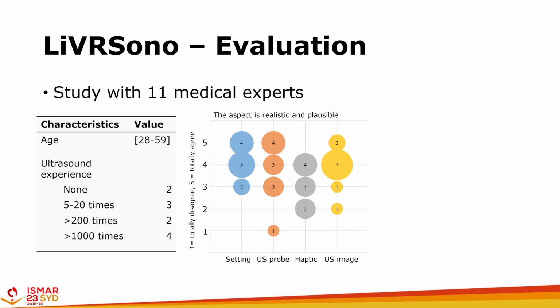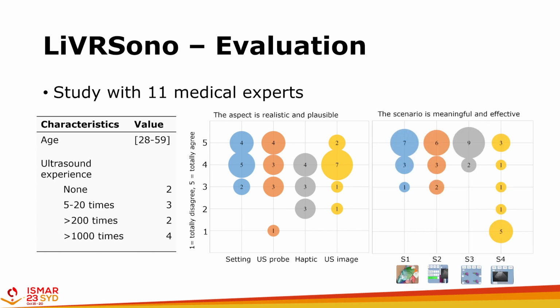The haptic was rated not that positive because of jittering and a limited range of movement of the device. In the second part, they had to assess the learning scenarios, so they were asked how meaningful and effective the scenarios are for the learning objective. The first and the third training scenarios, so the one with the segments and the models, achieved good results. The second one is also good and meaningful, but here the implementation should be changed. And the last one, reproducing the ultrasound image, is not meaningful because it's never necessary to reproduce a specific ultrasound image.